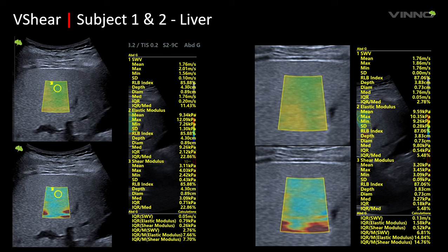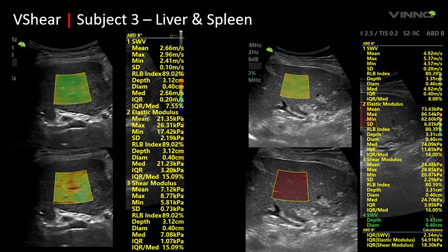Looking at a few images: on the left, Subject 1 shows the liver with a shear wave velocity of 1.76 m/s, with elastic and shear modulus within the recommended IQR/median ratio. On the right, Subject 2 also shows 1.76 m/s — both fall into the category requiring further clinical assessment for compensated advanced chronic liver disease. In a known patient with significant portal hypertension, the liver elastography shows a mean value of 2.6 m/s, well above 2.41, significantly correlating with significant portal hypertension. The spleen shear wave elastography shows 4.92 m/s, and literature suggests a cutoff of more than 2.4 m/s as indicative of clinically significant portal hypertension.